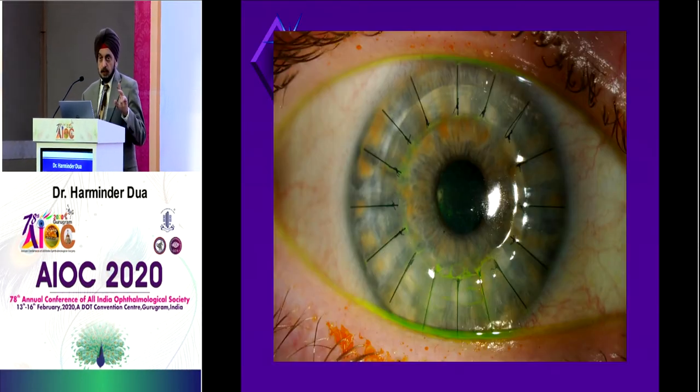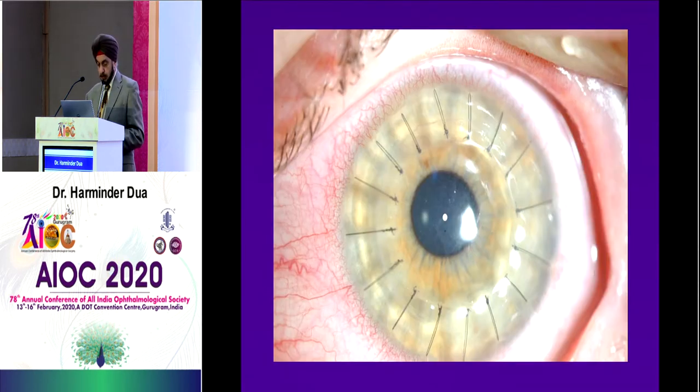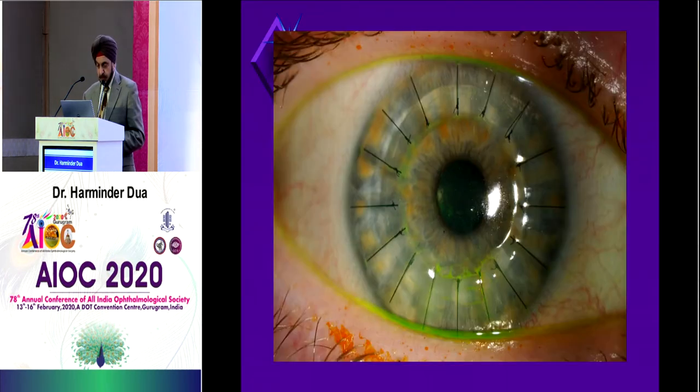So, two slides on the suturing. Remember the question that was asked. One of the things that's very important when you do the suturing is that all the lines should appear as one single line, as you can see over here. There was one which was not, but if you get a double contour for the line, then it's not right. Here, all of them are single straight. If your suture pass is not right, you will find a black line coming like that. Then you know that's not right. So that's one point.